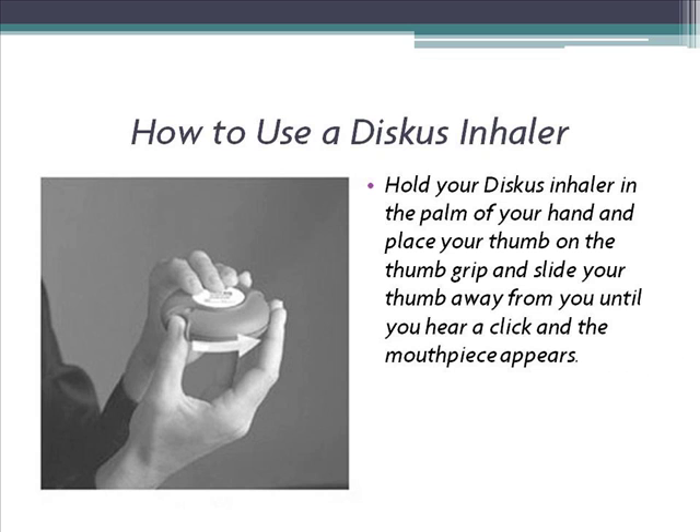1. Hold your Discus Inhaler in the palm of your hand and place your thumb on the thumb grip. Slide your thumb away from you until you hear a click and the mouthpiece appears.